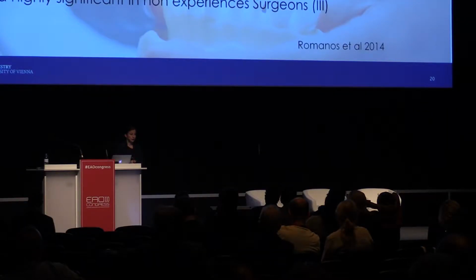And when you go to a recent study of Romanos et al., I really like it. He had master clinicians and good clinicians comparing with non-experienced surgeons who just got the drill the first time in their hand. And they showed highly significant differences between the clinicians and the non-experienced surgeons.